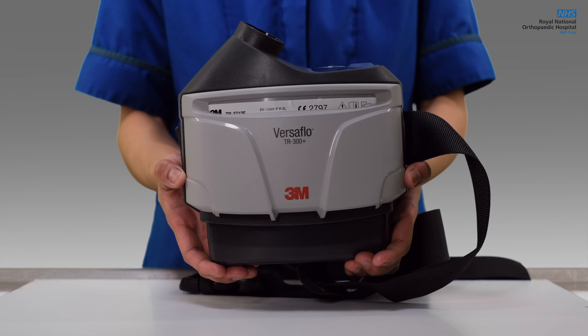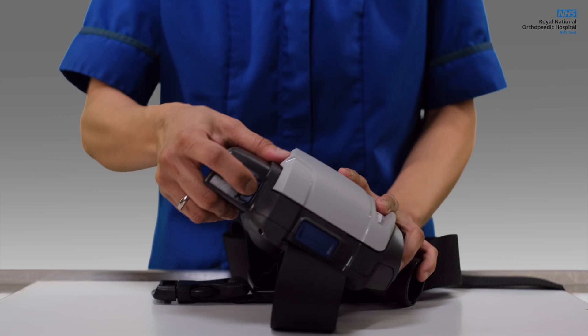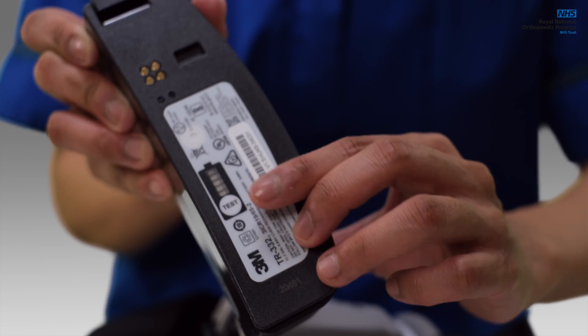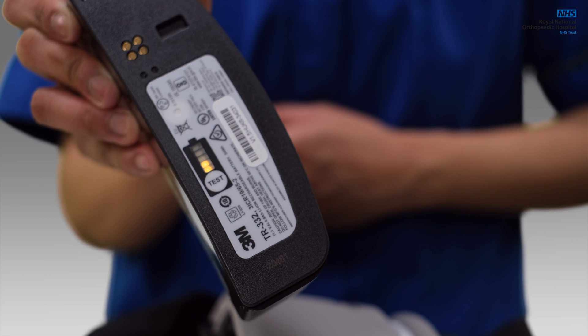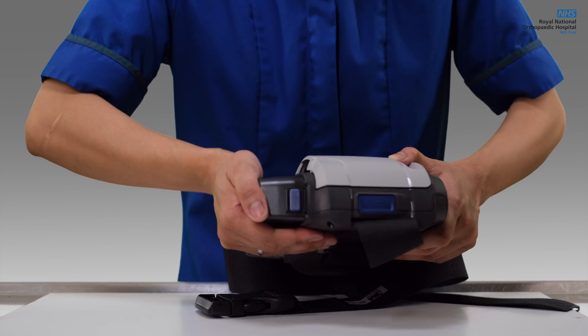The filter label should be visible in the cover window. To check the charging status of the battery, remove it from the device by pressing down the blue locking button. Now press the test button on the battery to check the charging status. If the battery requires charging, the battery indicator will flash. Reinsert the battery, ensuring that it engages with an audible click.